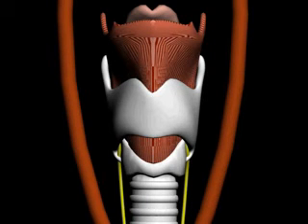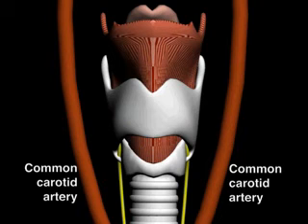Third, bleeding may occur. If minor vessels are injured, the bleeding can be controlled with direct pressure. If major vessels, such as the carotid artery or internal jugular vein, are ruptured, ligation may be required.